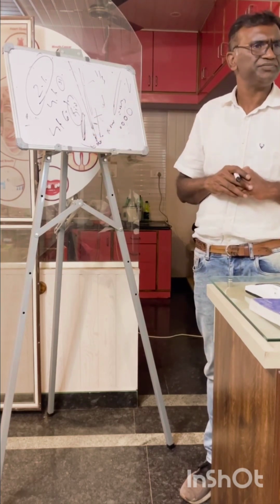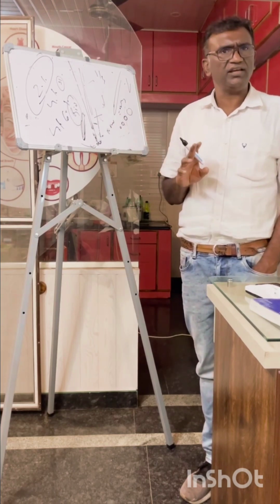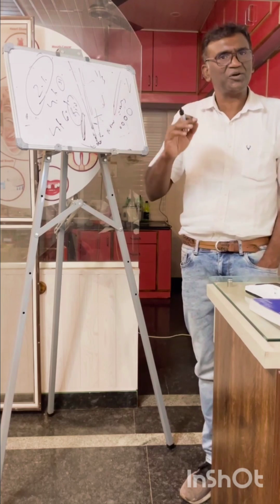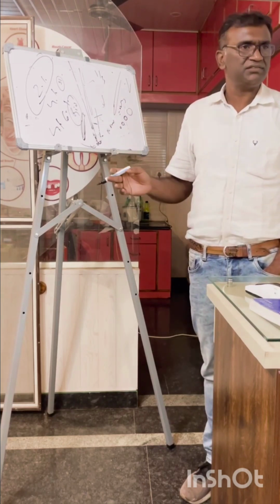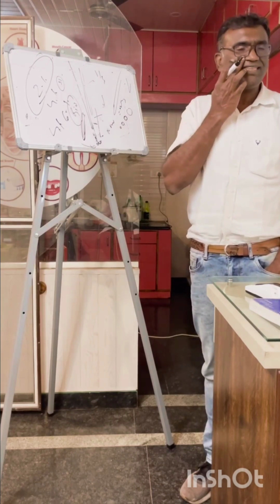That is biofilm. In that case, we have to widen. There is no other way. 6% for any canal. Okay, otherwise, because irrigation is very important.